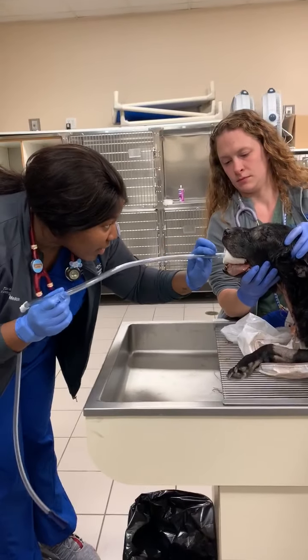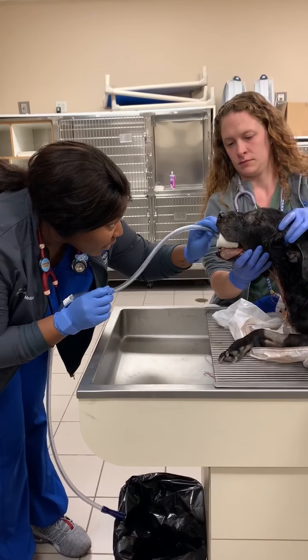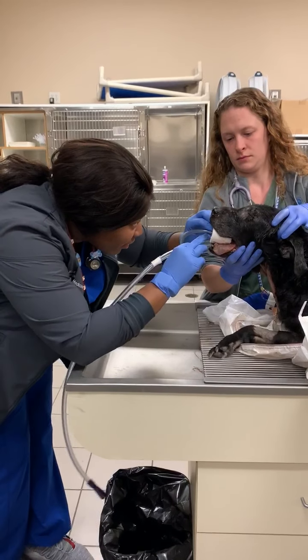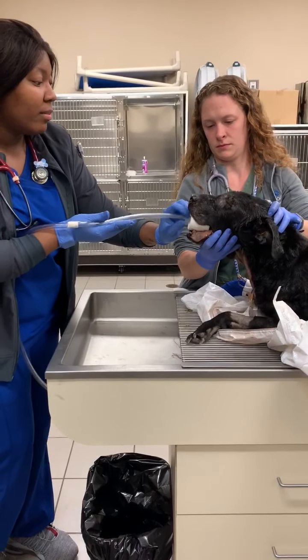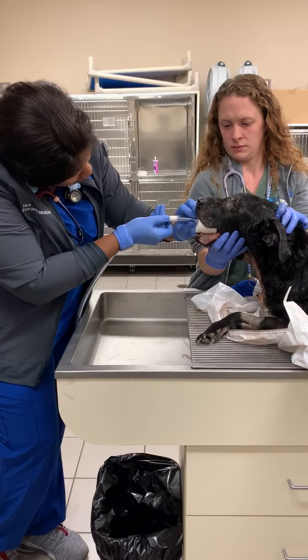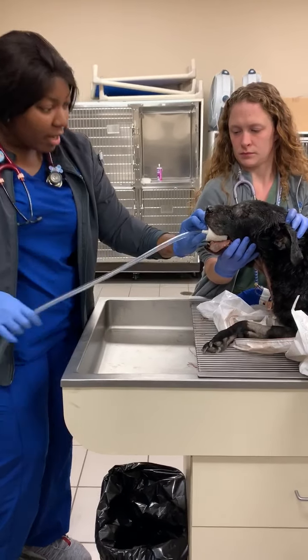So now we are going to go in. You always want to do it gently. Alright, so that is in.